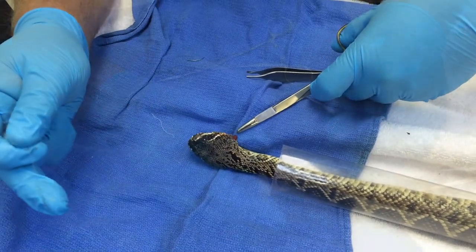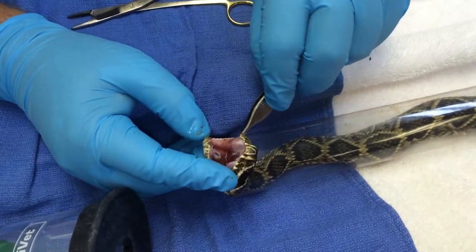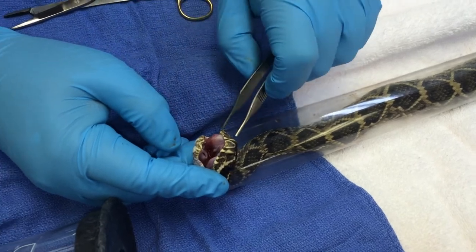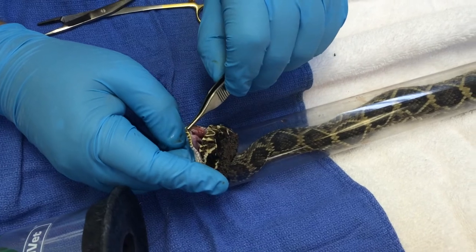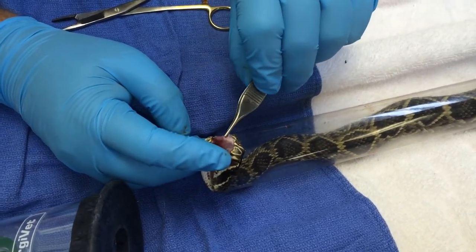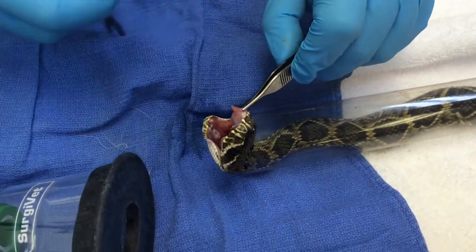So you'll be able to compile all these videotaping? Uh-huh. All right. You can actually see where all the bruising is on this side of the mouth. So it looks like the car actually went right across this area right here, and it just caused this to prolapse out. And according to the x-rays, there's not too much fracture in there. This tooth here is just going to fall out on its own. It's stuck inside the tissue there. Oh, maybe I can grab it. Hold on.